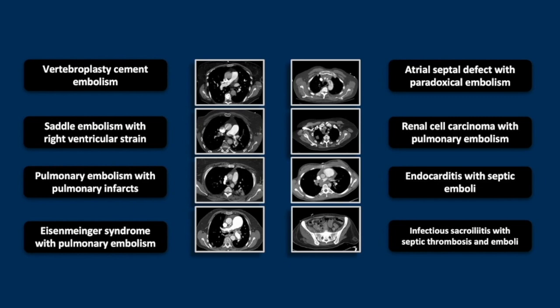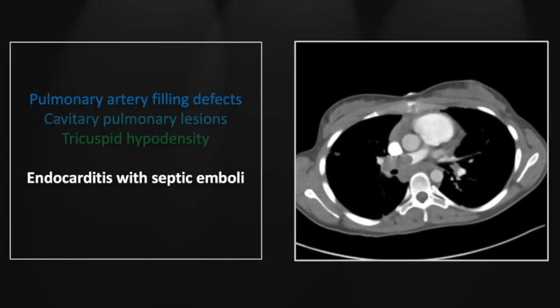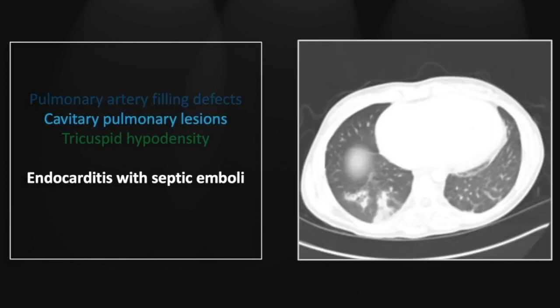Our next case is endocarditis with septic emboli. Many cases of septic embolization do not actually show the filling defect of an embolism, but here it is present to a great degree in the right main pulmonary artery. On lung windows, there are numerous small cavitary lesions as well as airspace densities that are generally wedge-shaped, consistent with embolic infarcts.